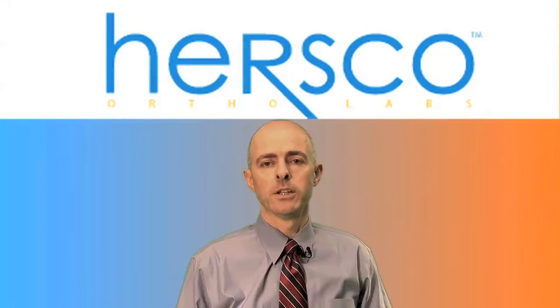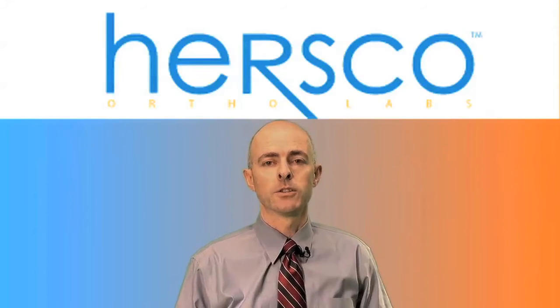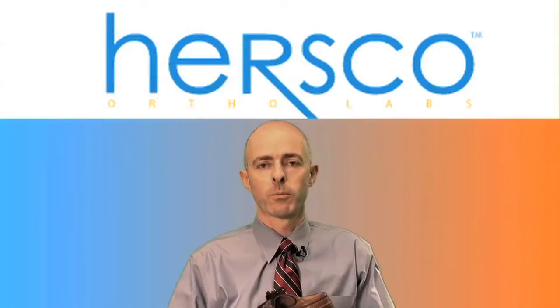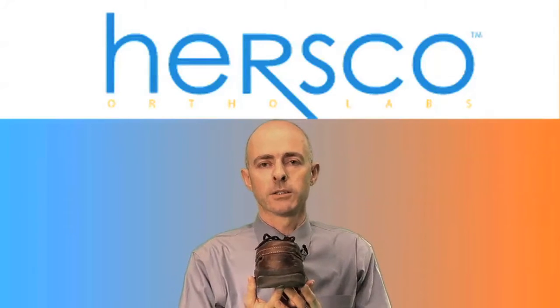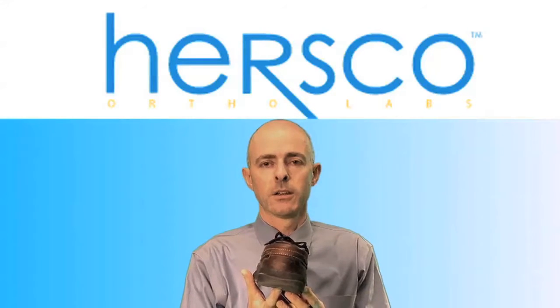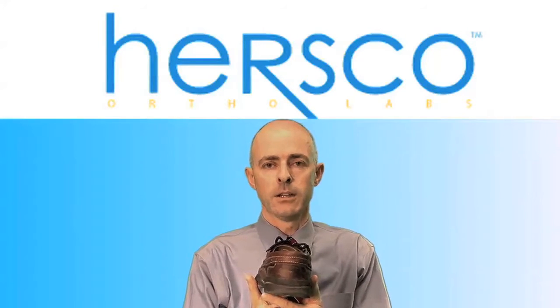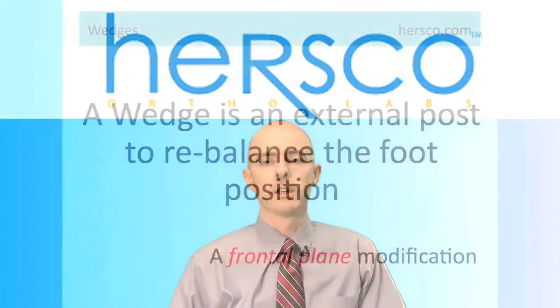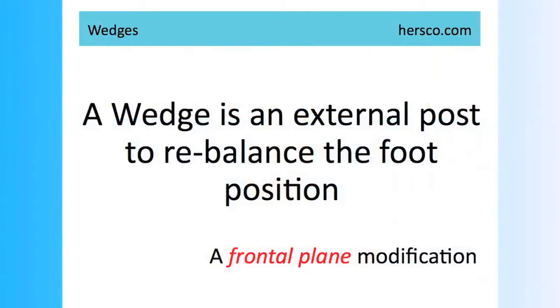A second common addition to the midsole of a shoe is to add a wedge. In that case, you're essentially going to post the shoe and tilt it up. So if the patient tends to pronate, you can add a wedge, in which case you provide material on the medial side to bring the foot closer to the neutral position. In the case where they supinate or they invert the foot, you would add the wedge to the lateral side.